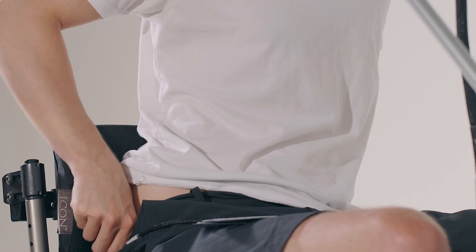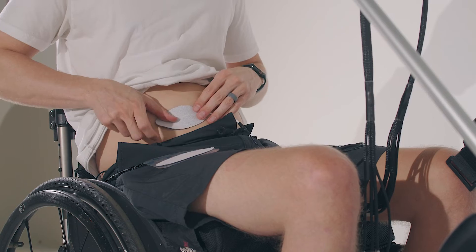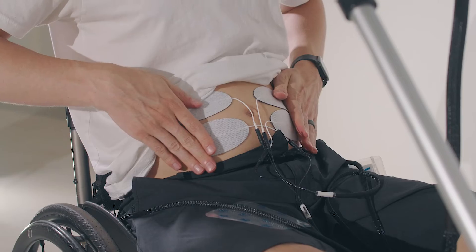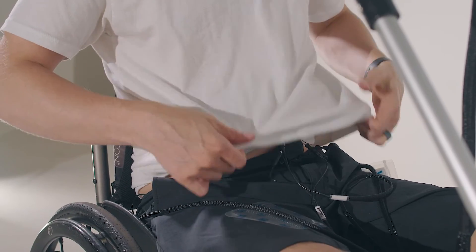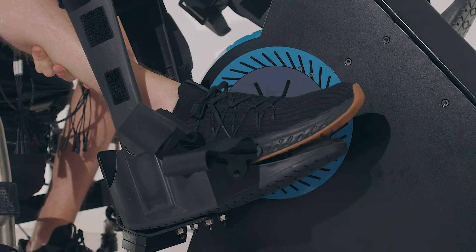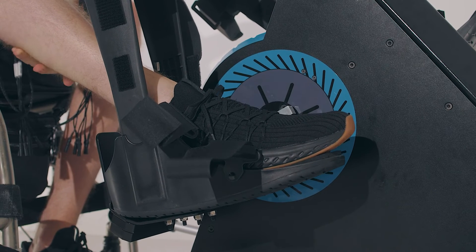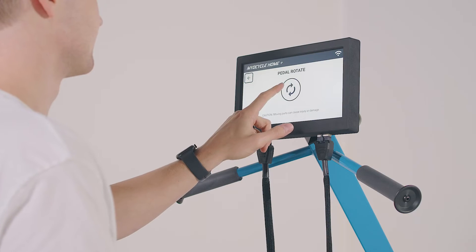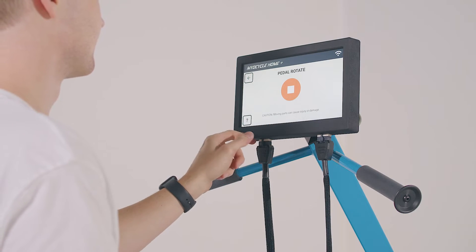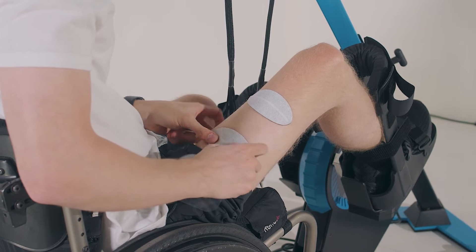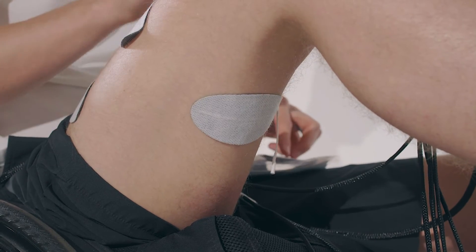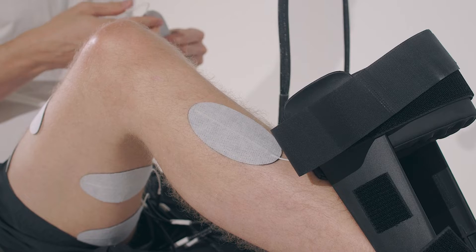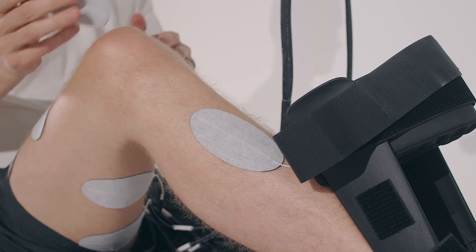The glute and trunk electrodes may be placed before your feet are secured to the pedals. Once those electrodes are in place, place your feet in the pedals. This is easier if the pedal straps are open and you use the rotate pedals function. Quadricep, hamstring, and lower leg electrodes can be easier to place once your feet are secured with the help of the pedal rotate function.